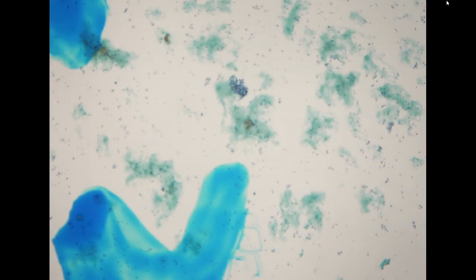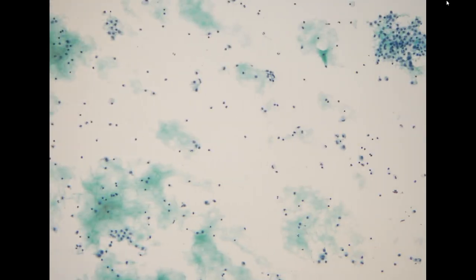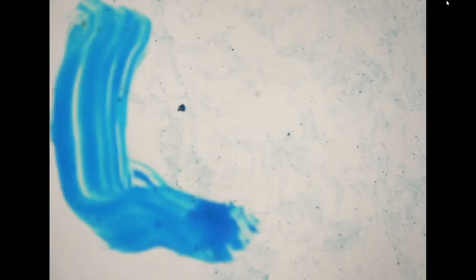The next specimen is an ascites specimen. The patient had a past history of gastric cancer. He has two different specimens. The first specimen is very paucicellular. We don't see a lot of cells in this specimen.